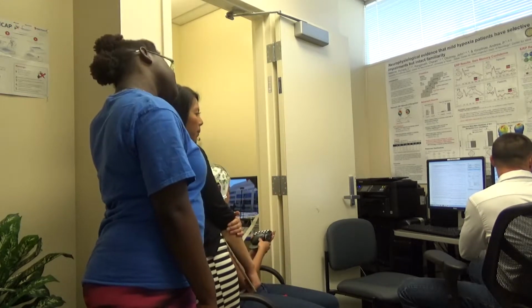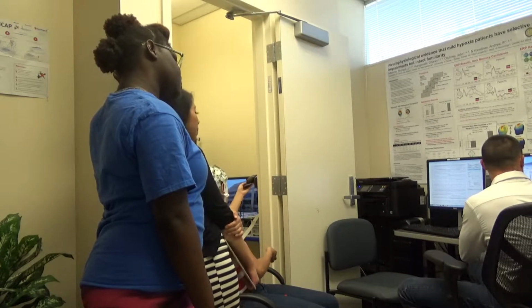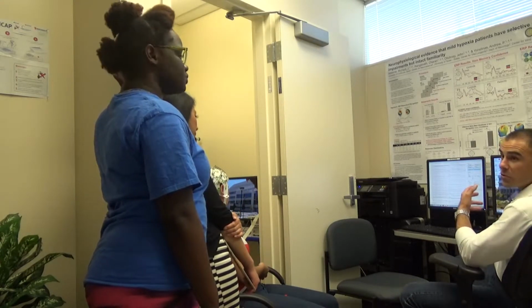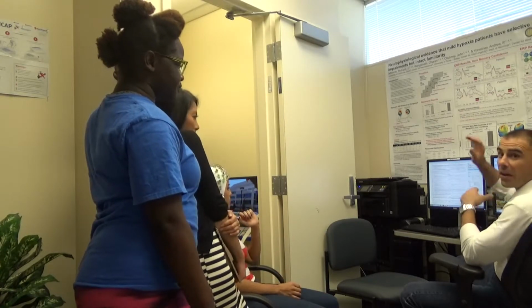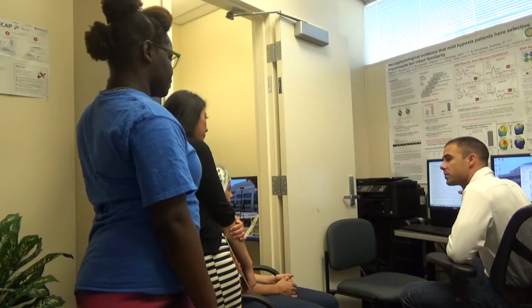You would cancel this out, and we would run through that. Close this out. This is where you would get your log files, like you guys are used to getting. And now we can start to categorize them on the back end once the subjects leave. We save this physiological data, and then we very carefully and very patiently and very slowly start to work with the electrodes and take them off the subject.